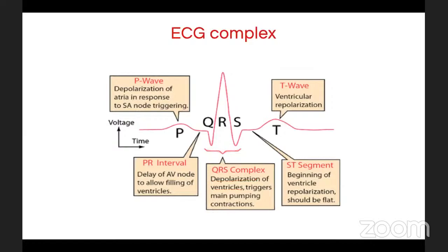أوكي طيب الحين عندنا ال ST segment. ال ST segment is beginning of the ventricle repolarization. أوكي يعني نعرف من خلالها إن الحين راح يبدأ الفنتريكل تسوي repolarization. طيب بس متى repolarization راح تصير؟ في T wave. نعرف أن T wave represents the repolarization of the ventricle. أوكي طيب معلش next slide.